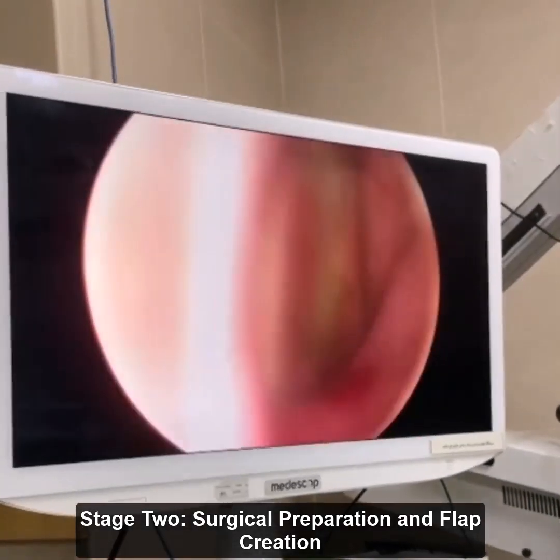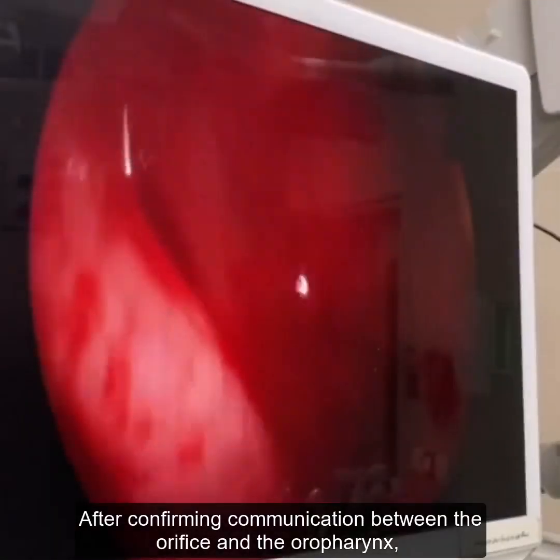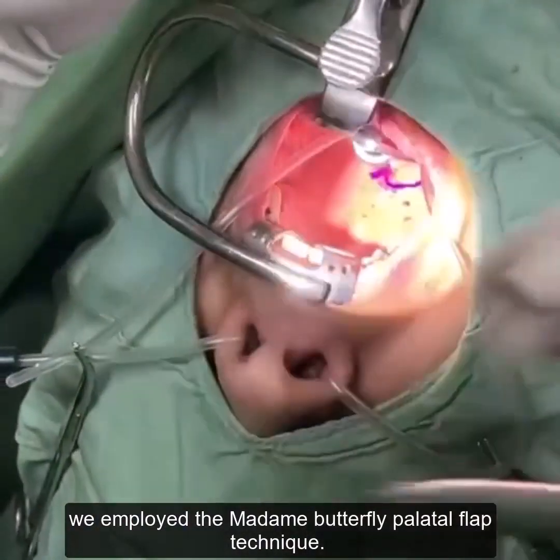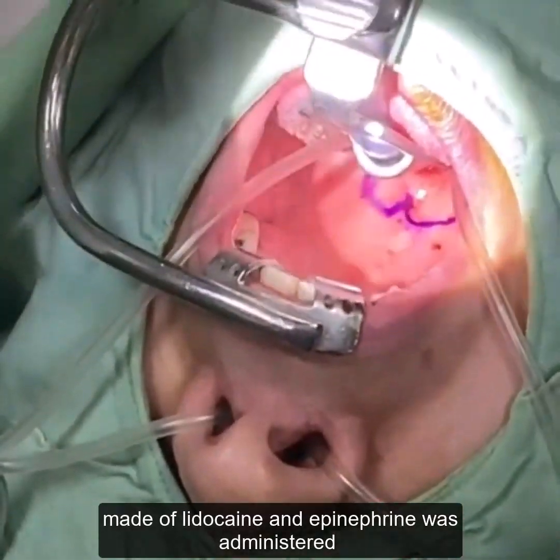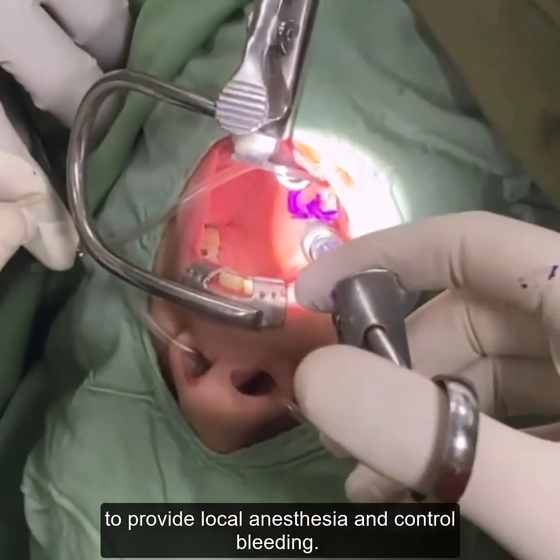Stage 2, Surgical Preparation and Flap Creation. After confirming communication between the orifice and the oropharynx, we employed the Madame Butterfly palatal flap technique. The flap area was first marked, and an injection solution made of lidocaine and epinephrine was administered to provide local anesthesia and control bleeding.